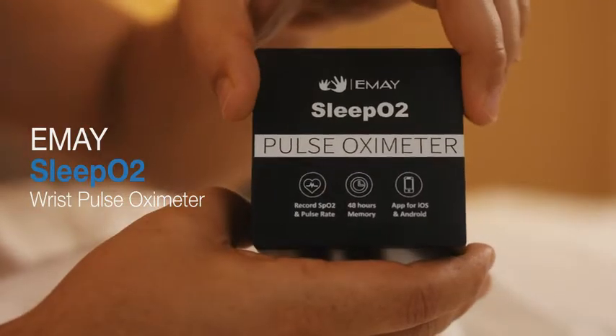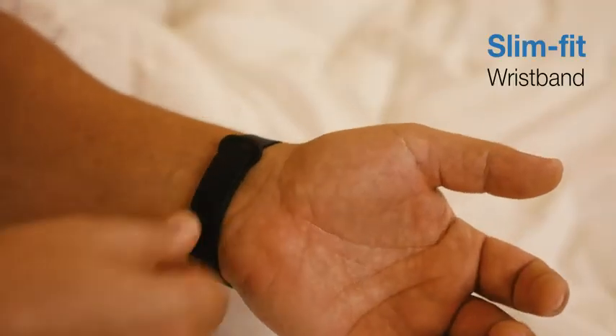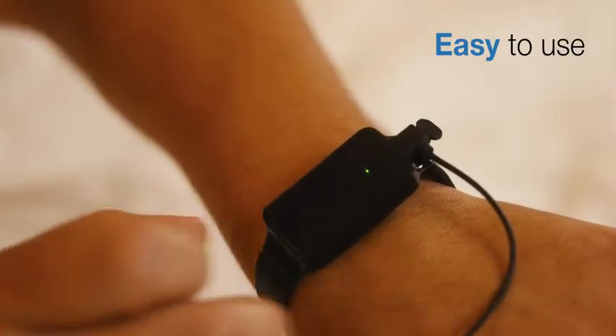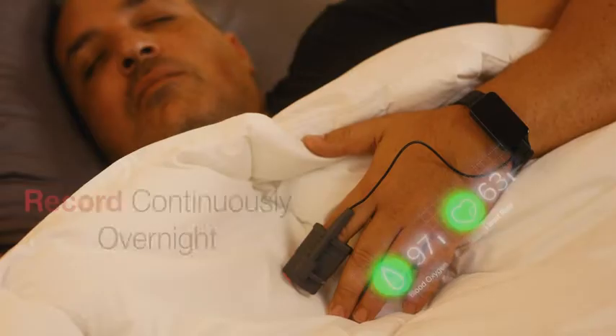Tracking your health isn't just for daytime hours. With the EMAY SleepO2 Wrist Pulse Oximeter, continuously monitor your blood oxygen and heart rate all while you sleep. The patented ultra-soft silicone probe fits comfortably while you sleep without falling off. Now you are all set to bed with SleepO2 tracking over the night.